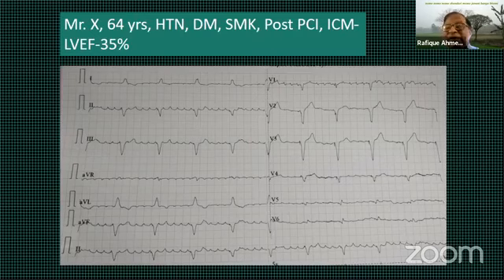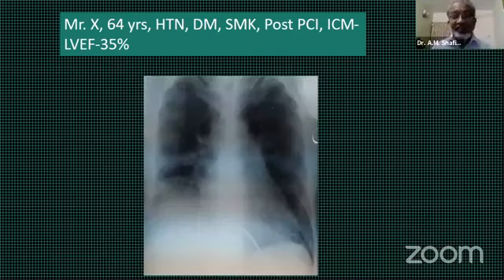Dr. Shafiq, please continue. Actually, sir, this is a permanent atrial flutter. The previous ECG of last year showed even the same ECG, and one day the ICD was done. Right, sir. Because a dual chamber could not be done because of atrial flutter. That was the decision taken from the very beginning.